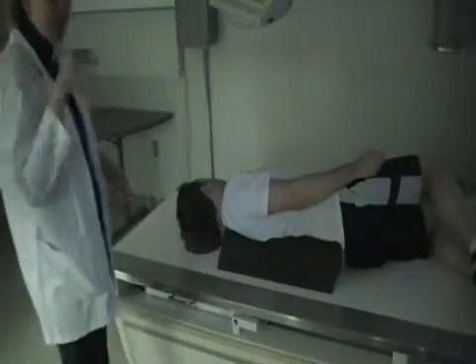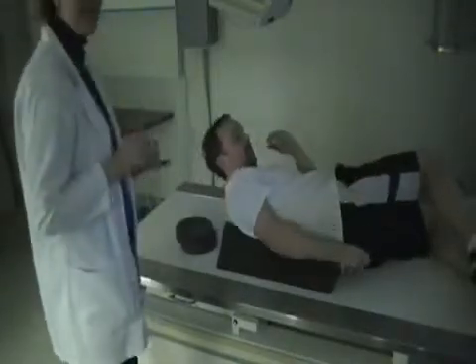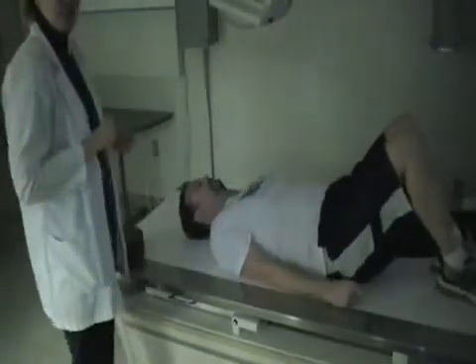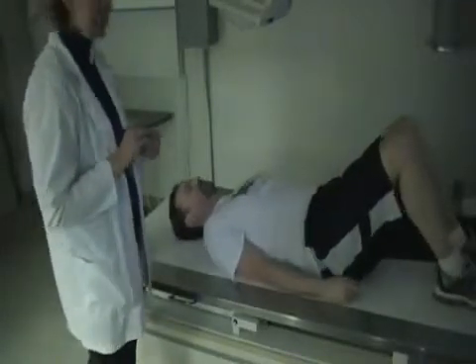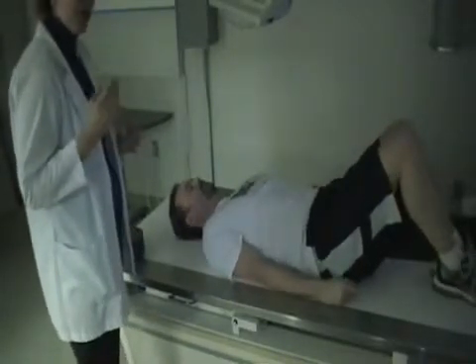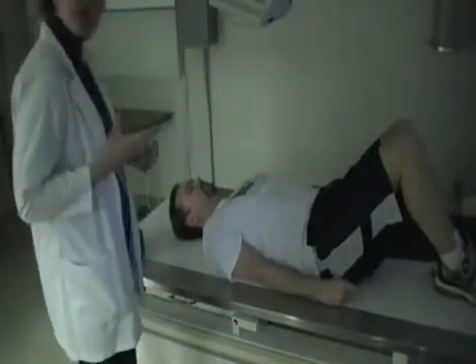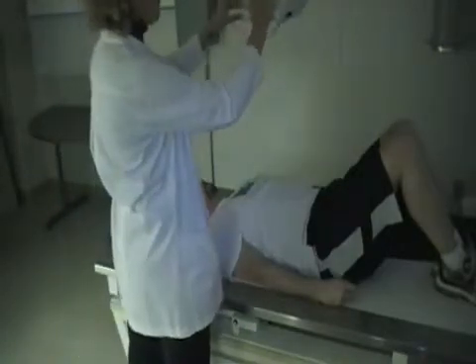Okay, one final image I would like to show you. Sometimes if you have difficulty on the open mouth being able to see the top of the dens, there is one other projection you can do to see the top of the dens. Because whenever you're doing the open mouth, you want to be able to see the dens in completion, because sometimes fractures occur in that area. So we're going to do the Fuch method.